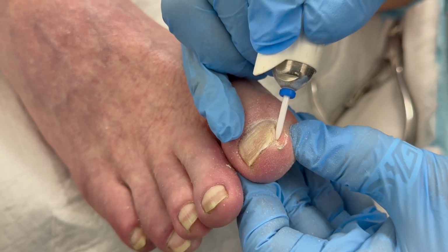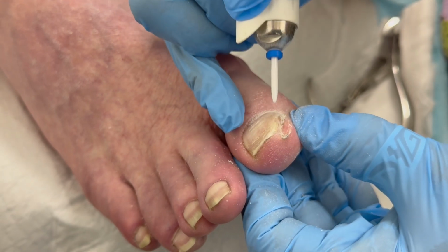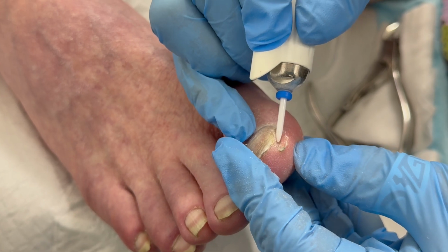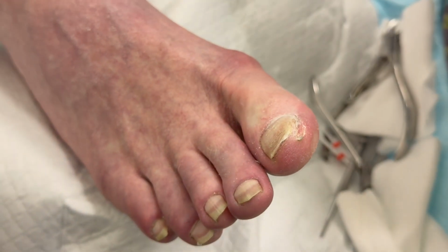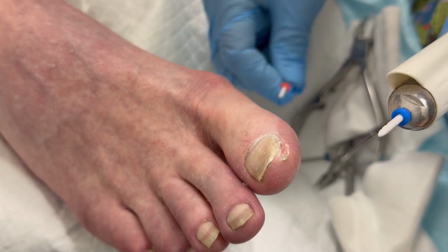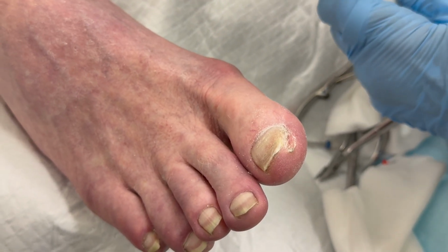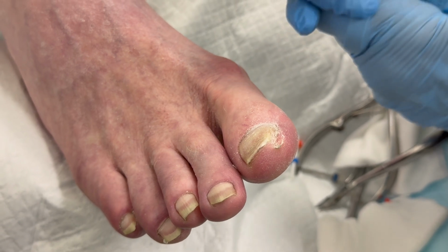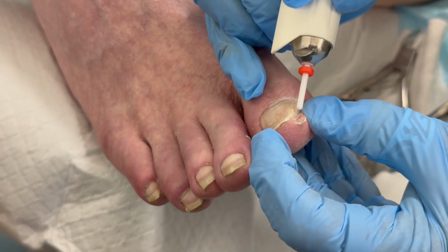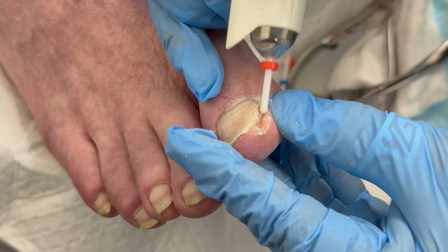Okay, so back to here. Okay, I'm going to switch now back to the ball pointed one. No, I think I'll use the original one and then kind of clean that up. See, this is why I feel more like I'm a foot sculptor artist instead of a foot nurse. It's just very fun for me. Okay, so now cleaning it up.